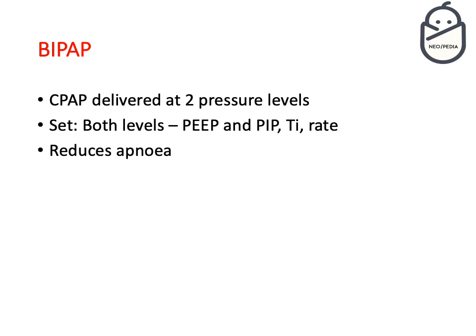Again, I'm not going through the evidence or more information about that. Let us just concentrate on how it works in this condition. So again, the same problem with the CPAP can be caused by BiPAP, and usually the BiPAP is not synchronized, so there is no synchronous breathing with the baby's breathing, so that's another problem also.